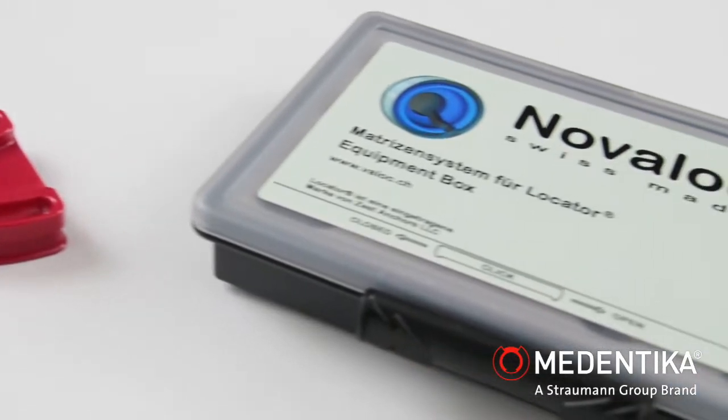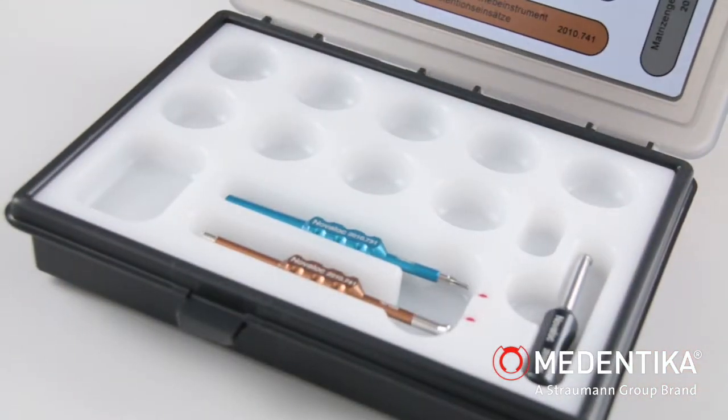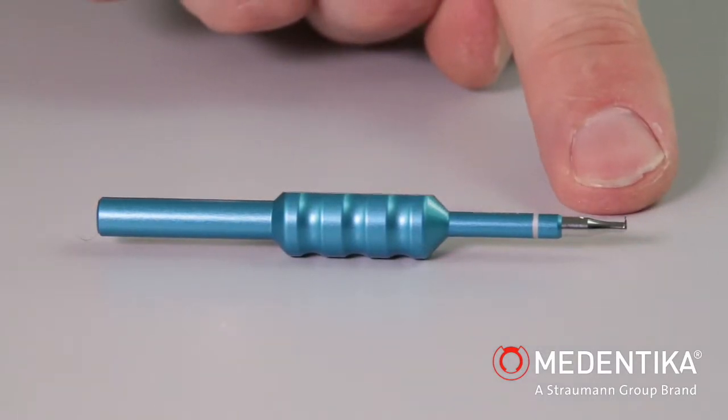The NovaLock equipment box contains three instruments. The NovaLock extractor for the assembly insert, blue, is dual functioning.